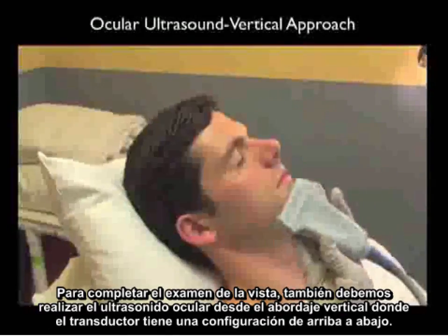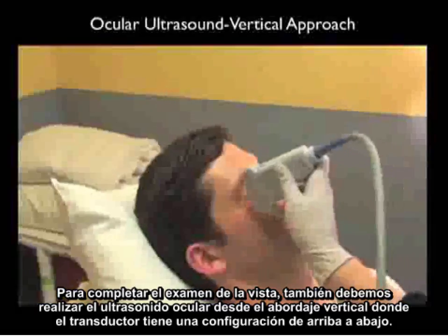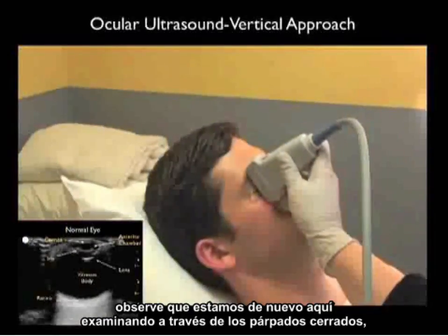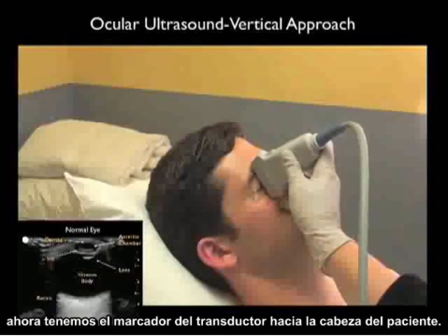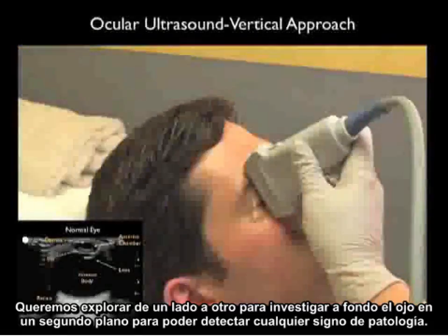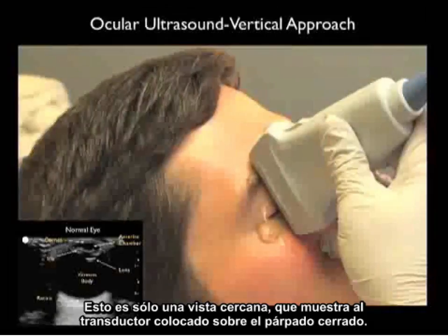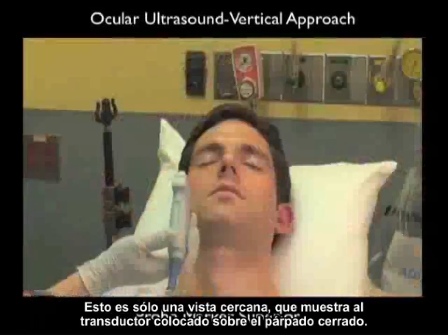To complete our examination of the eye, we should also perform ocular ultrasound from the vertical approach, having the probe in an up and down configuration. Note here, we're again scanning through the closed eyelid. Now we have the probe marker up towards the patient's head. We want to scan from side to side to fully investigate the eye in a second plane for any signs of pathology. And here's just a closed-in view showing the probe placed over the closed eyelid.